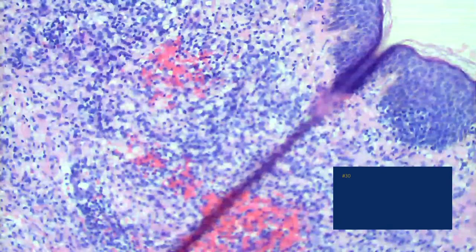So it looks like inflammatory at first glance, doesn't it? It does. So sometimes things break the rules. They look inflammatory, but they're really not. Could this be syphilis again? Didn't think it was. Good. What did you think it was? I thought it was something very inflamed. Okay. What did you think was very inflamed? That's good.